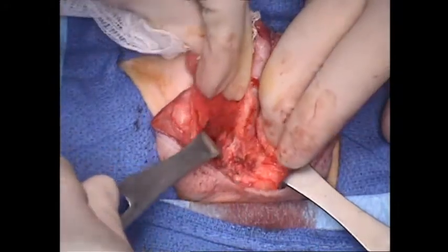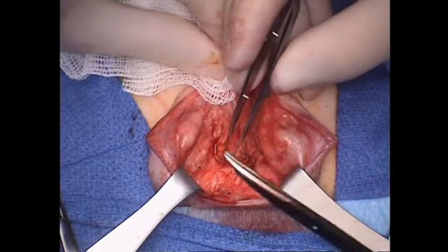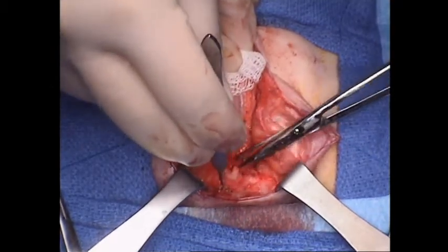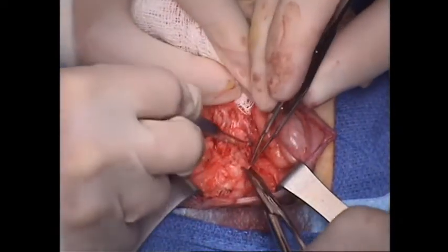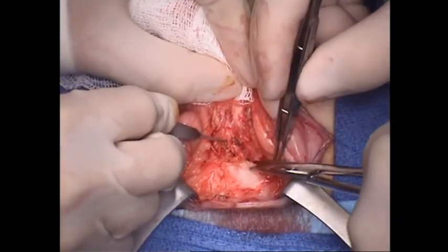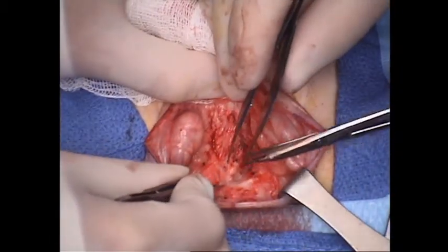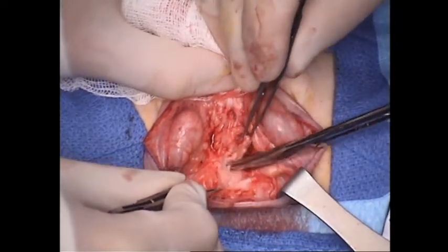Making sure that we can see. So now our scrub is holding the retractors here so that we have all hands available for this dissection and great visualization of which direction the urethra is heading, because it's impossible to know in many of these boys. Is it heading down in a more orthotopic location, or is it still traveling more superficially than it should be? In this boy, it looks like it's actually turned the corner and is traveling now in a more normal location.